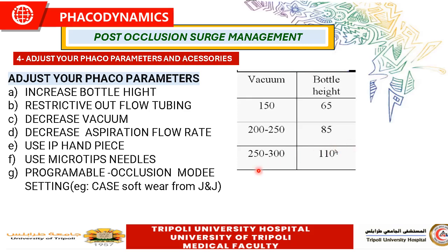So this is among the measures of utilizing the phaco needles to counteract the post-occlusion surge, or management of the post-occlusion surge: the presence of the ABS needles and also the micro tip technology to counteract the post-occlusion surge.